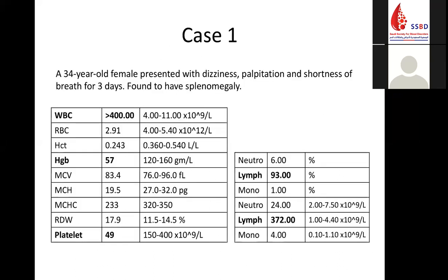Through the cases, we'll go through the findings in leukemia and lymphoma. The most common, maybe not everyday cases, but at least you can see them.